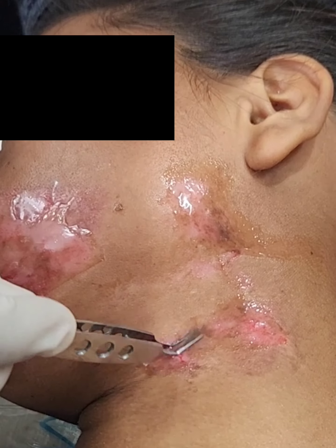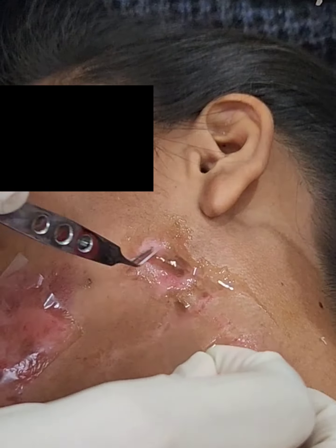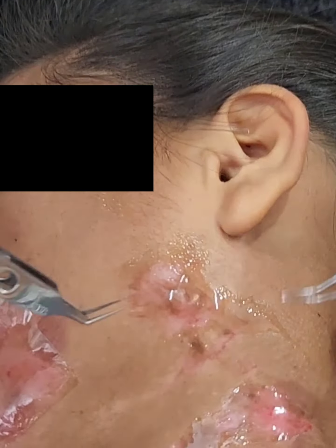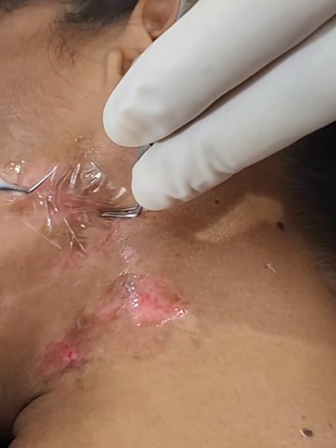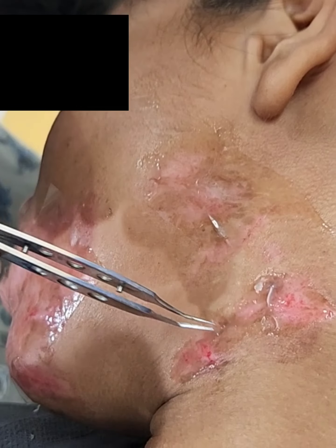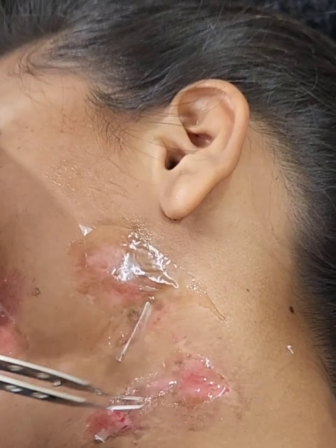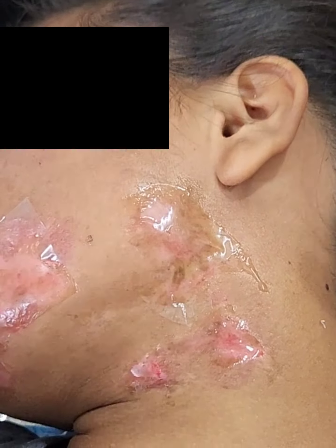The cells are evenly spread onto the dermabraded recipient area. You can see the brownish color thick suspension, which is very rich in melanocytes. The area is then closed with a dry collagen sheet placed onto the recipient area.